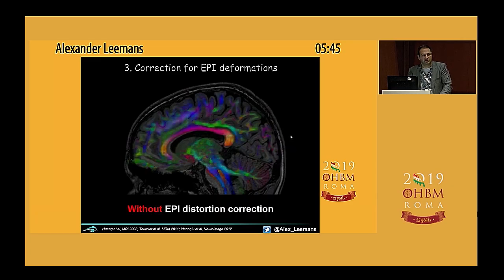And the trick to doing this with an image registration-based approach is basically you can constrain it heavily by just looking at what are my degrees of freedom of the deformation. And in this case, it's along the phase encode orientation, right? So what you can do then is say, let's constrain all these degrees of freedom for unwarping the deformation in that image plane. And so if I now show it from a sagittal point of view, you'll understand this. This is before correction, after. Okay? So you can appreciate that the deformation is only in the front-back orientation, right? And so that makes it easier to come up with the global optimum for alignment.